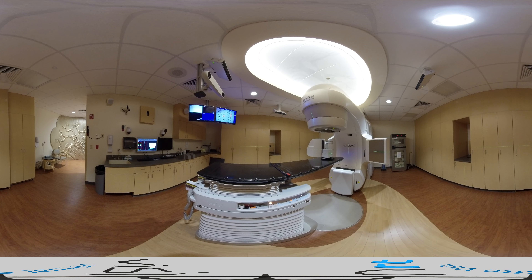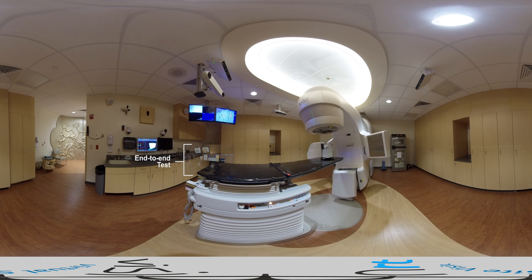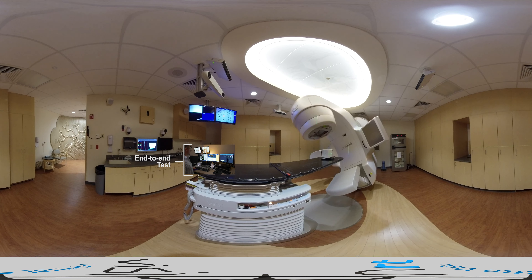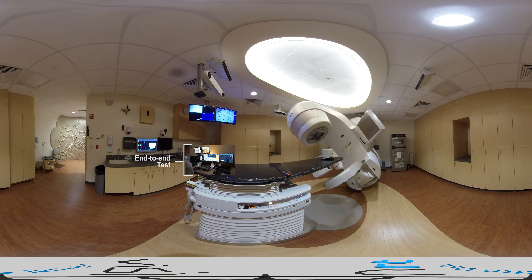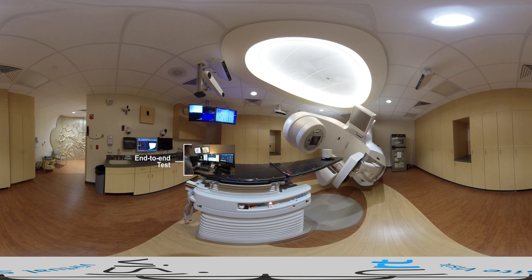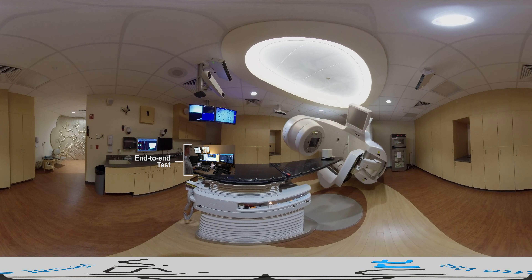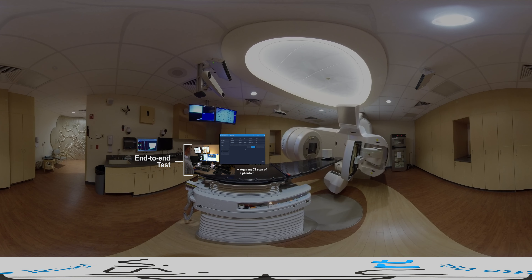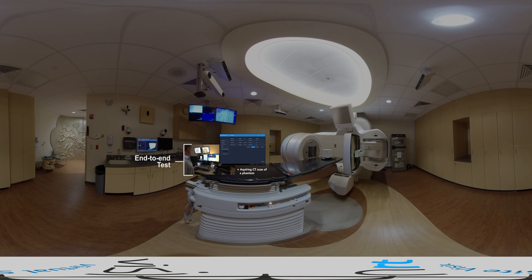An end-to-end test can be an effective way to perform a comprehensive QA of your AlignRT system and of the processes involved with treating patients using SGRT. Our end-to-end tests begin by acquiring a CT scan of a phantom. We use the calibration cube and typically position it at a 45-degree angle, although other anthropomorphic phantoms have also worked well.